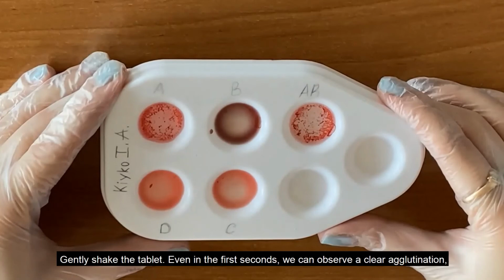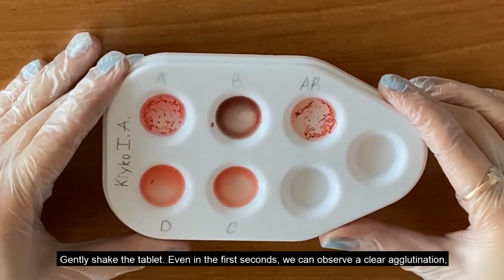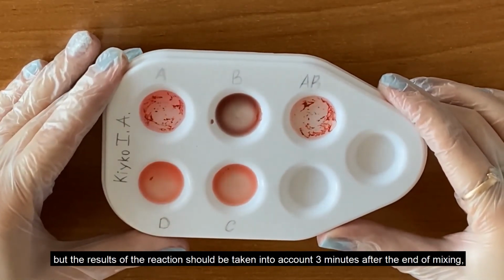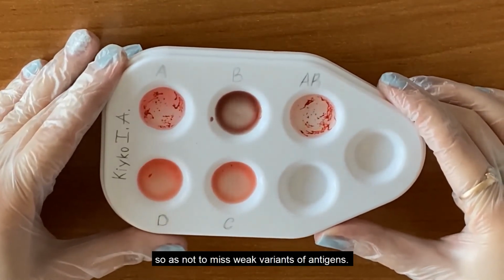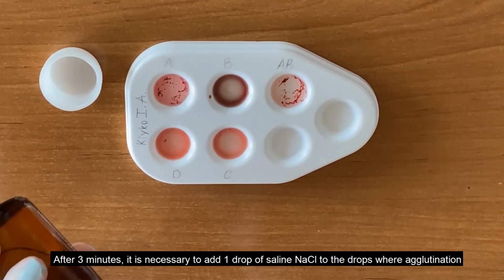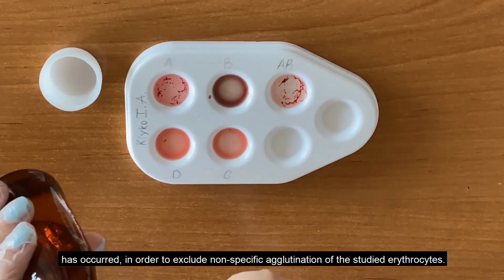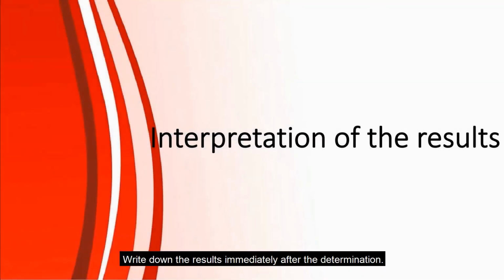Gently shake the tablet. Even in the first seconds we can observe a clear agglutination, but the result of the reaction should be taken into account 3 minutes after the end of mixing, so as not to miss weak variants of antigens. After 3 minutes, it is necessary to add 1 drop of saline sodium chloride to the drops where agglutination has occurred, in order to exclude non-specific agglutination of the studied erythrocytes. Write down the results immediately after the determination.